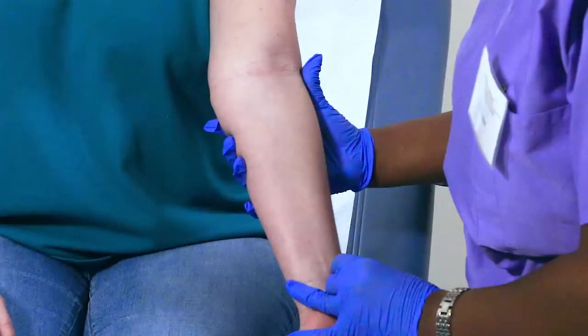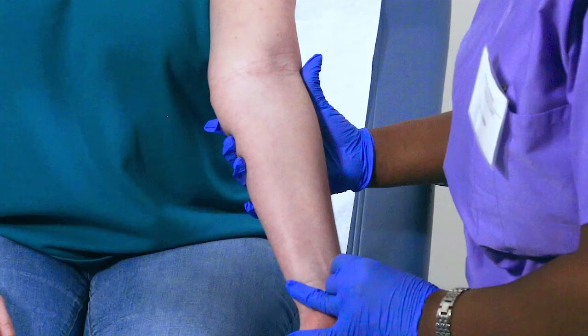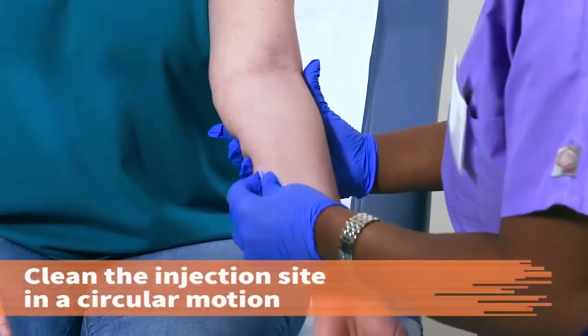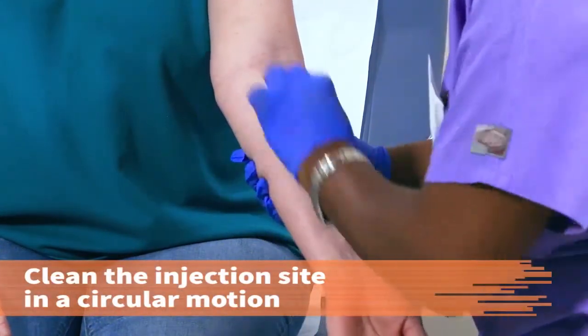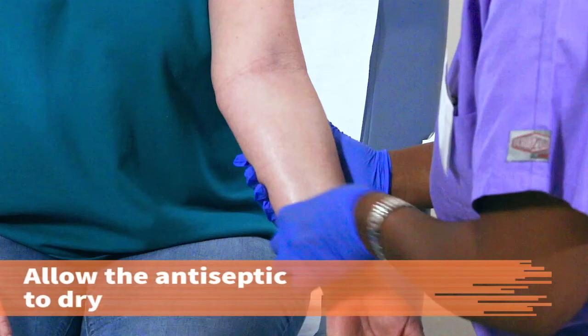Place your non-dominant hand on the back of the patient's forearm to pull the skin taut. Another option is to wrap your thumb and the first 2 fingers of your non-dominant hand around the patient's forearm, pulling downward and apart to stretch the skin taut at the location of the injection. Cleanse the patient's skin with an alcohol wipe using a circular motion, moving from the center outward and creating about a 2-inch area. Allow the antiseptic to dry.